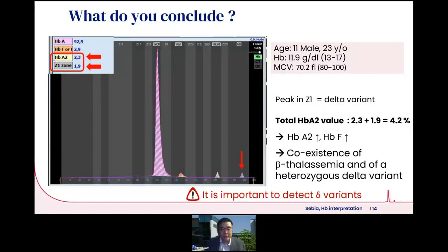So let's take a look at a typical case example. So here you have a male patient with a hemoglobin level which is low, 11.9, out of the reference range, and also an MCV that's low as well, out of the reference range. In this instance, the profile looks like the hemoglobin A2 is being split. So very likely there should be a delta variant that's present. However, the delta variant is not supposed to give you a clinical presentation of lower hemoglobin or MCV.